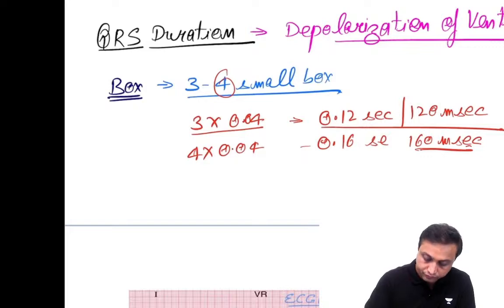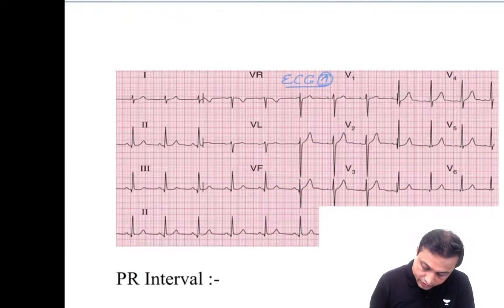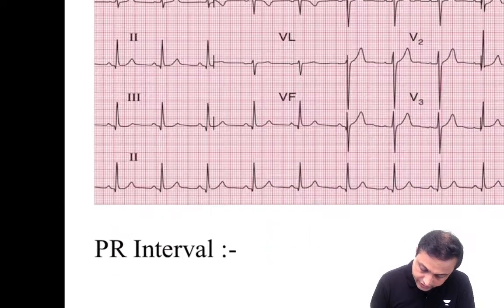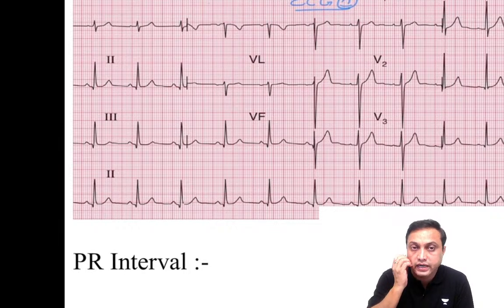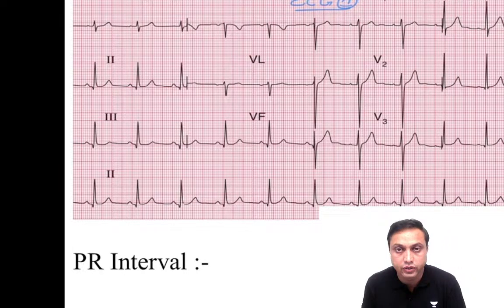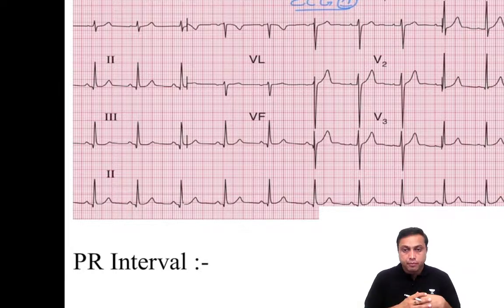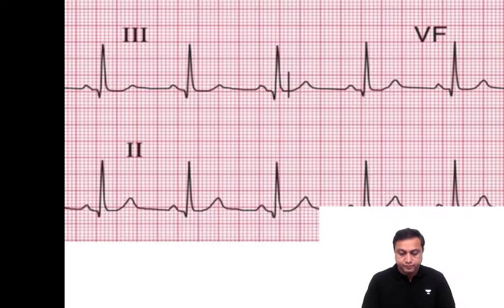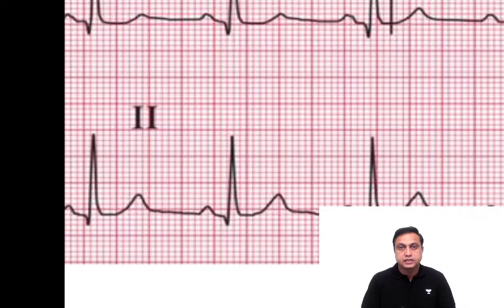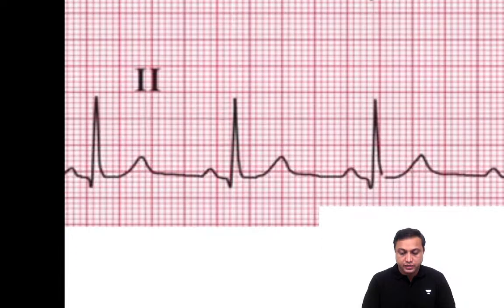Now guys, in this ECG, I request all of you to please tell me what is the time of the PR interval. Let's do a little bit of practice. Can you please tell me what is the time of a PR interval over here? You have 40 seconds to answer me. I can zoom it. Please calculate the time of the PR interval in this ECG.